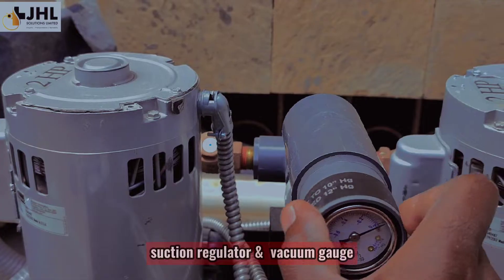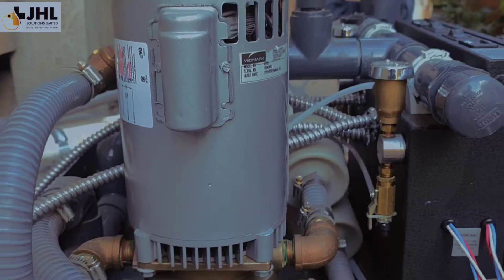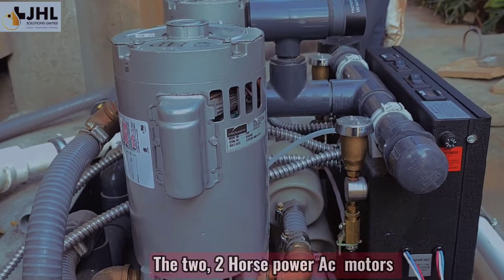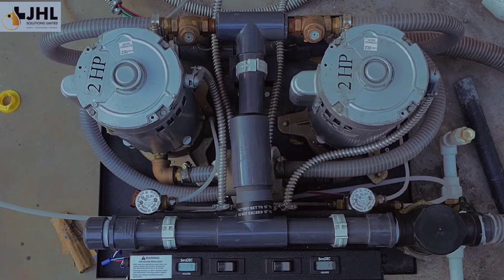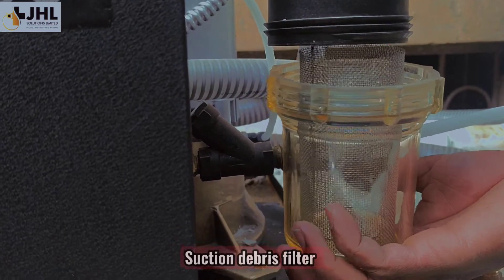Suction regulator and vacuum gauge. The two two-horsepower AC motors. Suction debris filter.